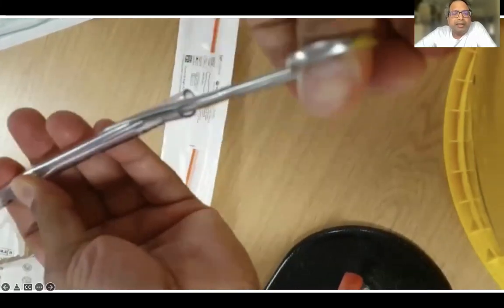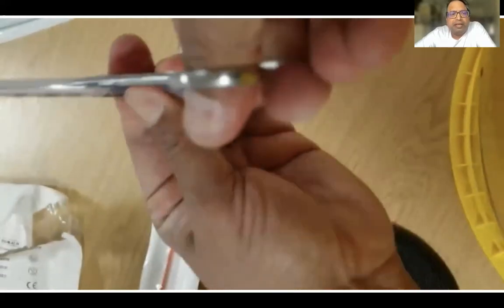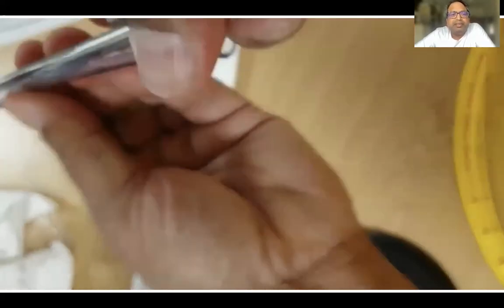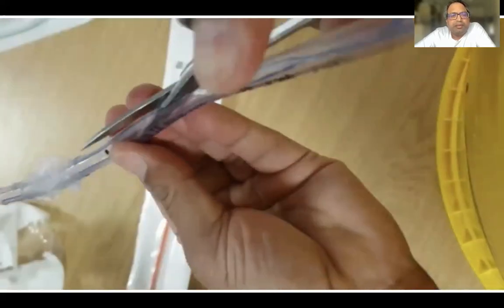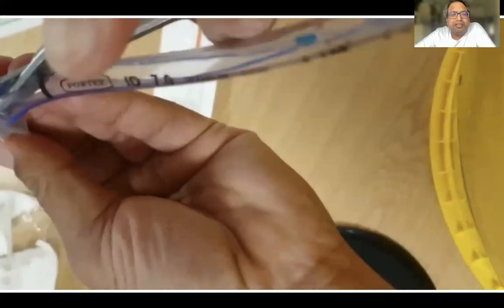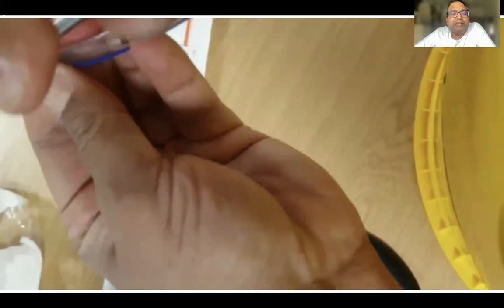So here we are actually splitting. I have detached the cuff, and now I'm splitting the tube through the center. You need a nice sharp scissors for this. You can use a blade, but be careful. Don't injure yourself while splitting that. I have used a blade as well for doing that previously.